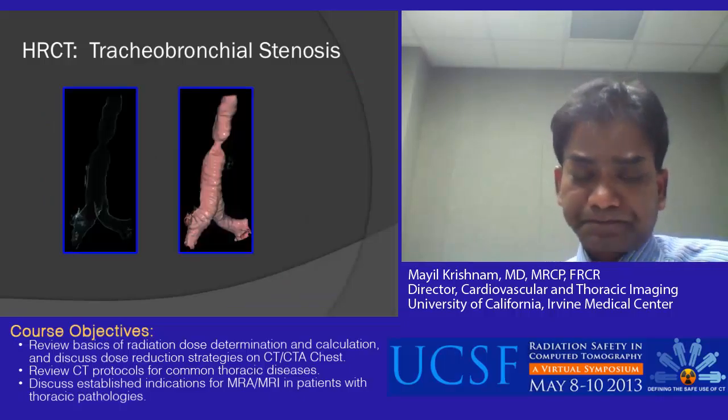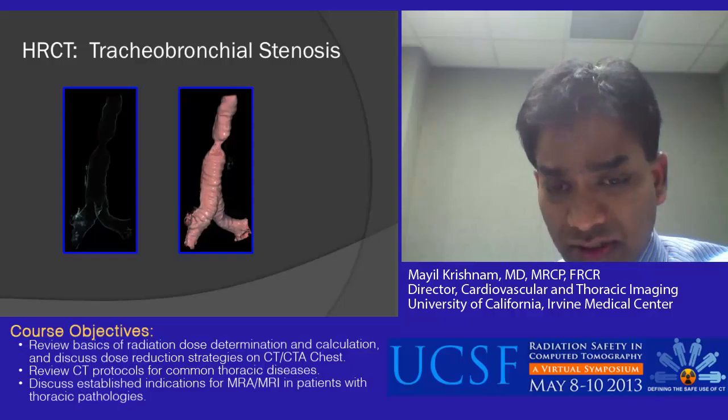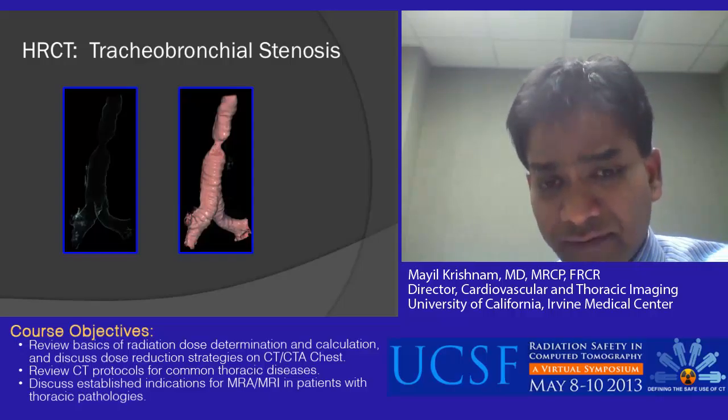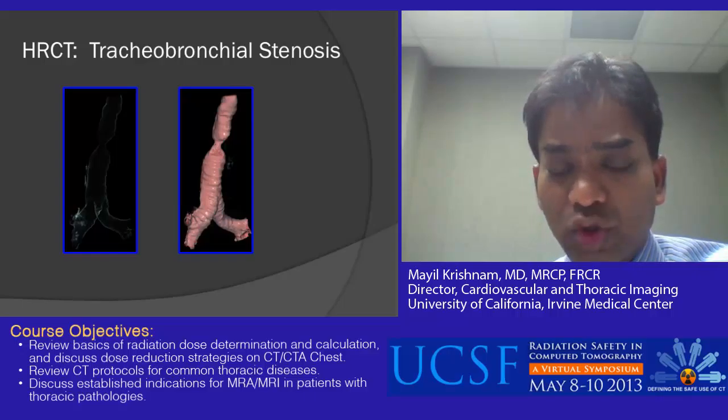Next slide. Different patient with tracheobronchial stenosis, post-intubation stenosis of the trachea, and these 3D images are performed on supine volumetric inspiratory scan.